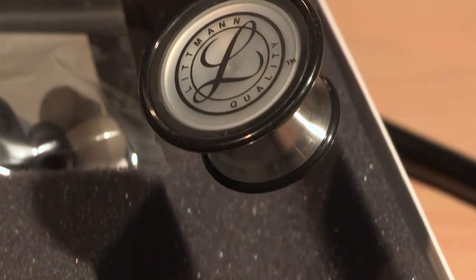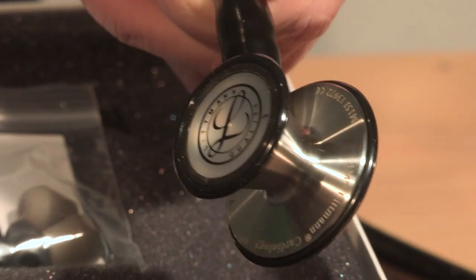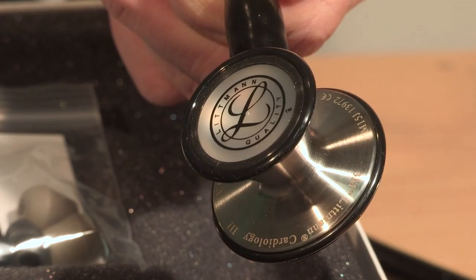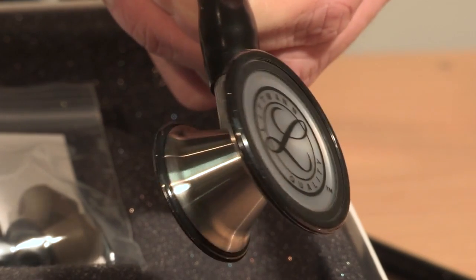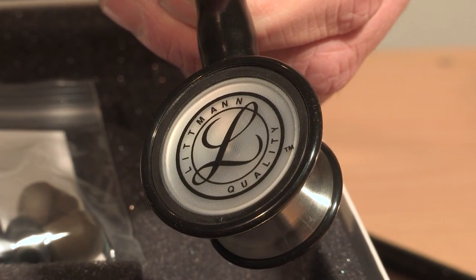The large side of the chest piece is suitable for auscultating adult patients, whilst the small side is best suited to pediatric or low BMI patients. The stethoscope features non-chill rims on both bell and diaphragm.